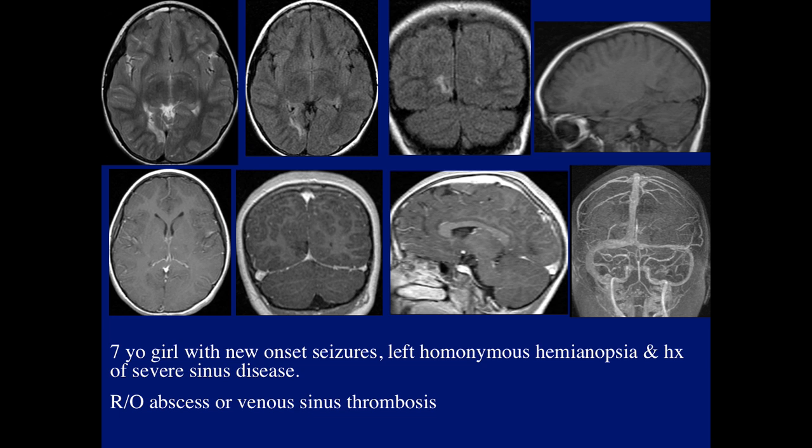Anybody see any abnormalities in this? She had a normal diffusion study and a contrast study and a venogram, MRV. Anybody see anything? The post-contrast study showed no abnormalities. The venogram, the MRV showed no abnormalities. There was one finding here, and I told them not to worry about anything, that the findings are long-standing. Anybody sees what I'm referring to?